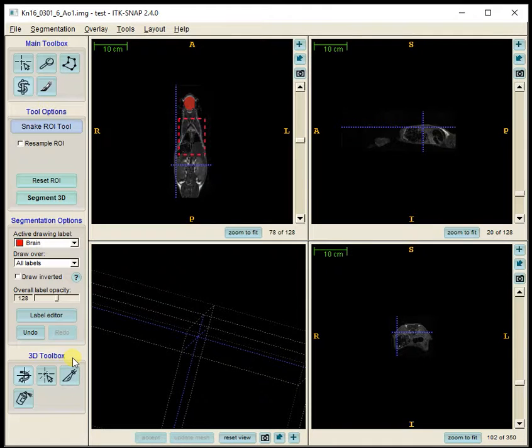Videos describing how to capture or do the organ segmentation from whole body mouse MRI data using ITK Snap. At this stage we have segmented the brain, and leaving off from the last video I was showing how to proceed with segmenting the lungs. But what I want to show here, because of course it's crucial to finish this, is how to actually get the volume. So if we're doing segmentation with the goal of finding the volume of an organ or different organs.